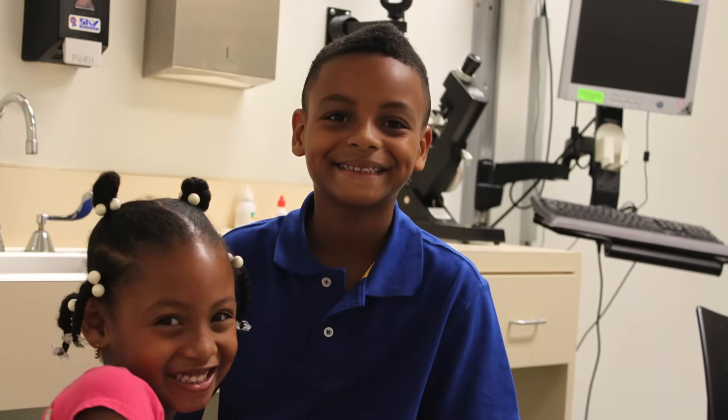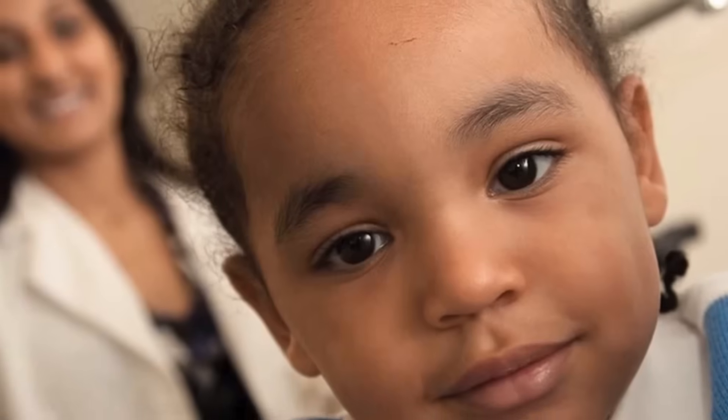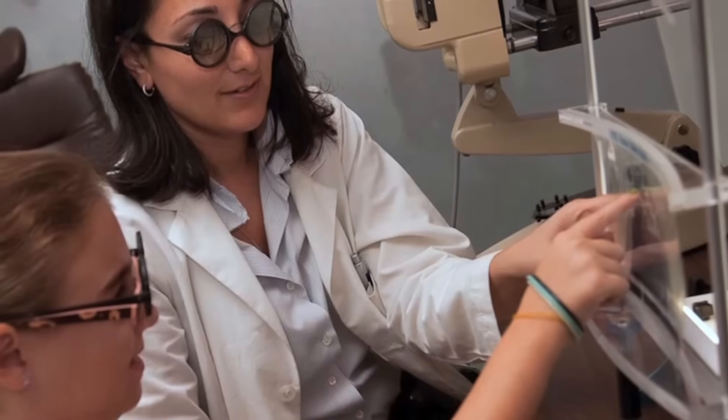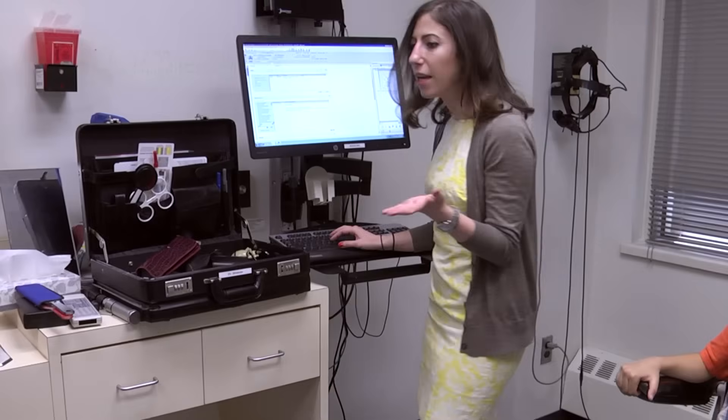A pediatric exam is very different than an adult eye exam. In this video, we'll show you the different steps that happen during a pediatric exam.